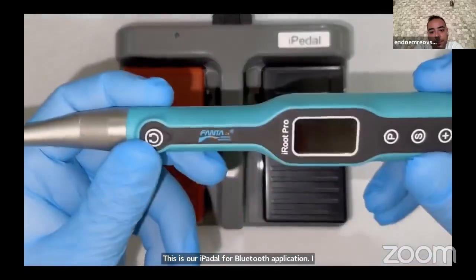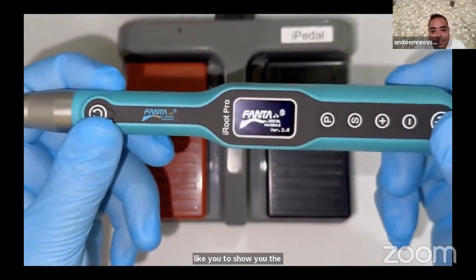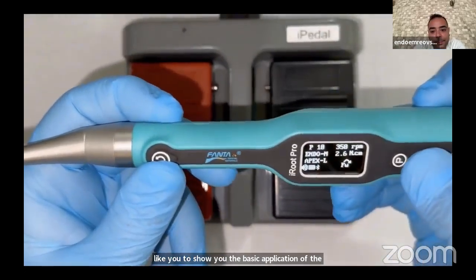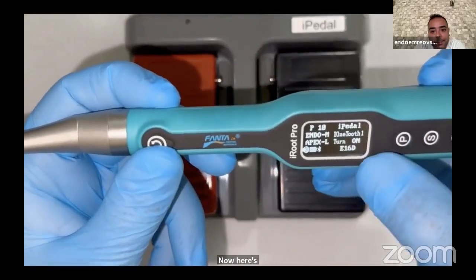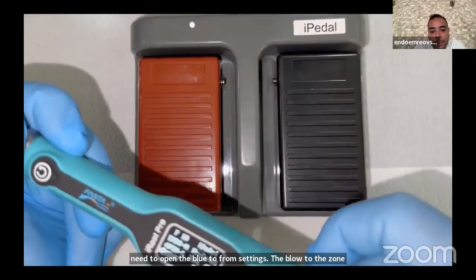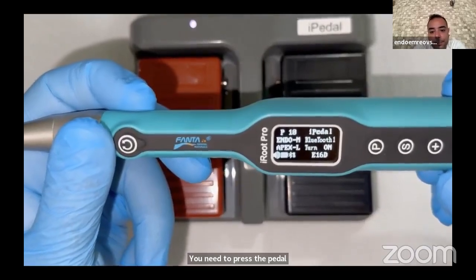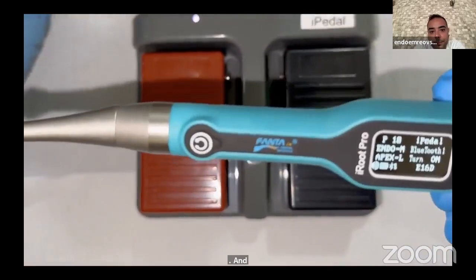I would like to show you the basic application of the Bluetooth connection. Now here we need to open the Bluetooth from settings. The Bluetooth is on. You need to press the pedal. Very easily connected. And now it's connected. It's a very nice type of usage for clinical applications.